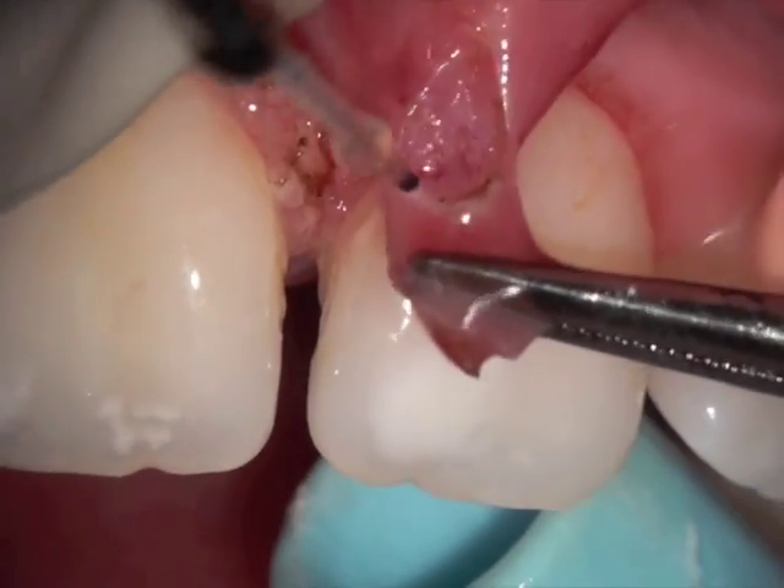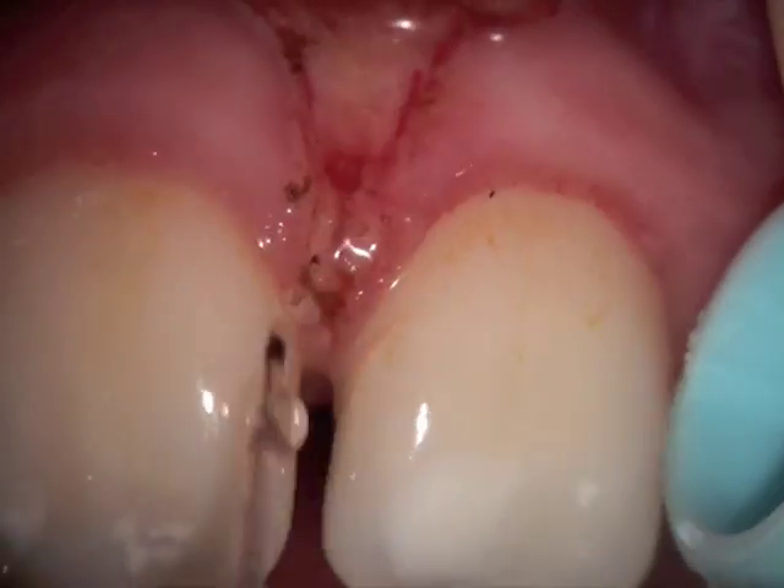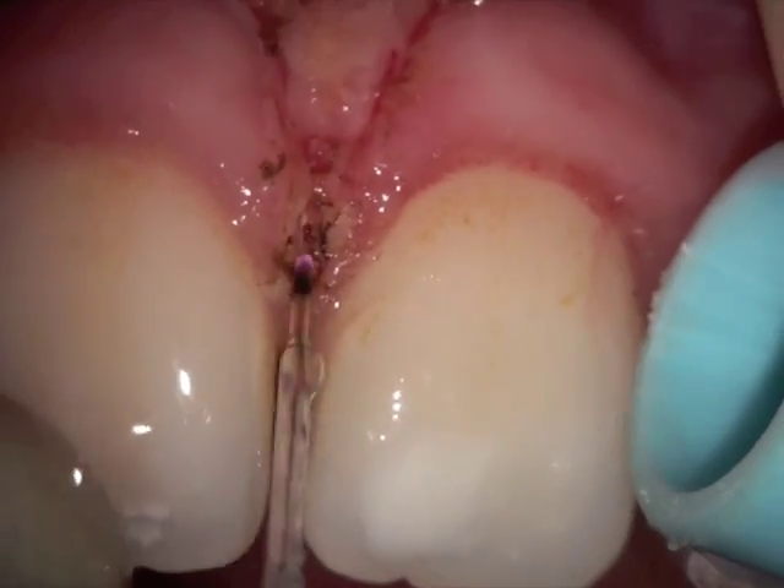I actually left a little bit — I should have removed a little bit more. It's actually fairly vascular, bleeding a little bit more. And we go back in and remove some more of the fibers that were going right in between the teeth.